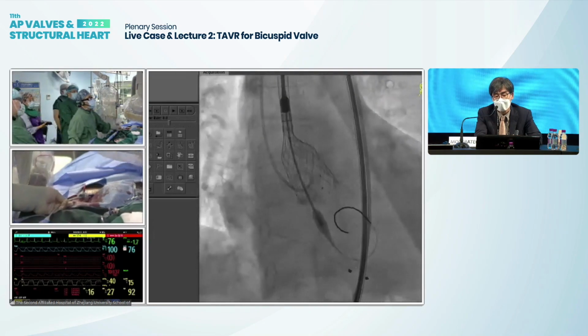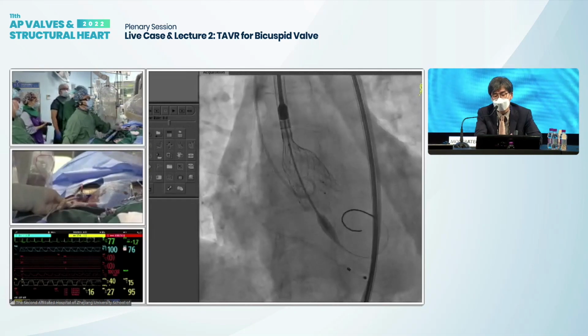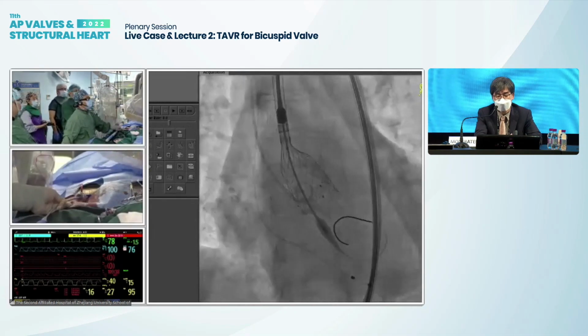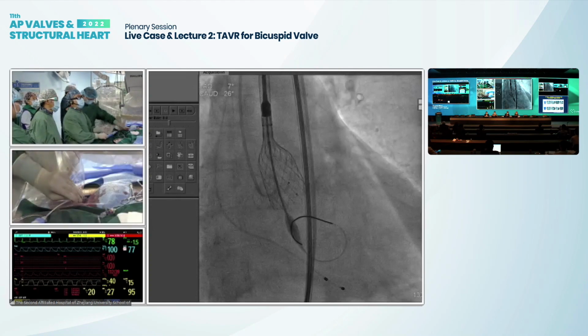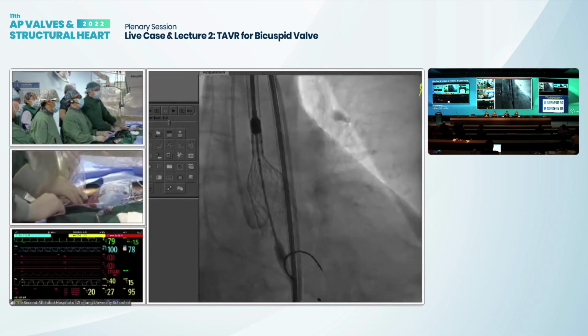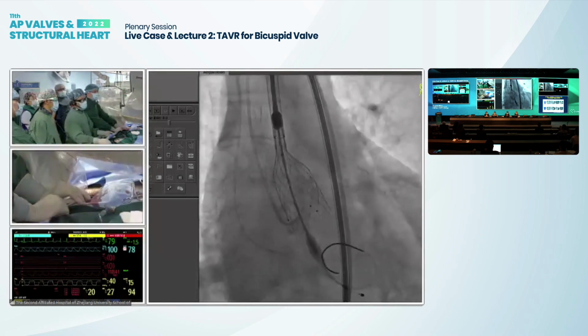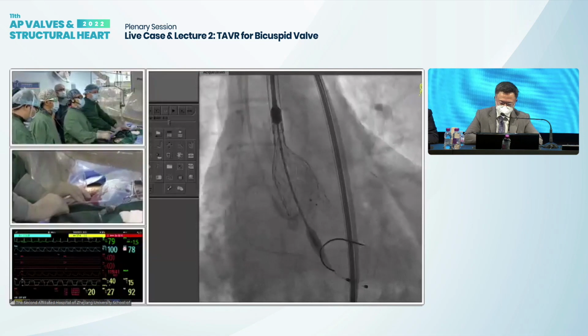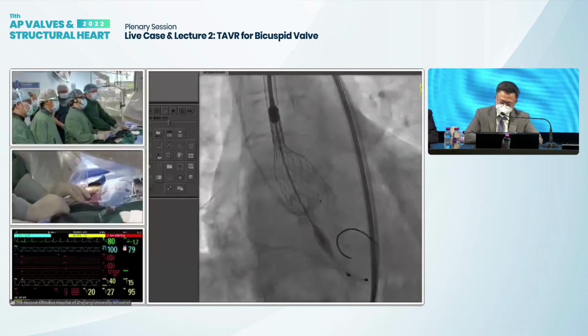At that time, the possibility of migration might be higher, pumping up. I'm not satisfied with the alignment, I'll push forward a bit. Yeah, I favor retrieval as well. Go a little deeper, not too much, maybe a few millimeters deeper. Okay, I agree with your suggestion.